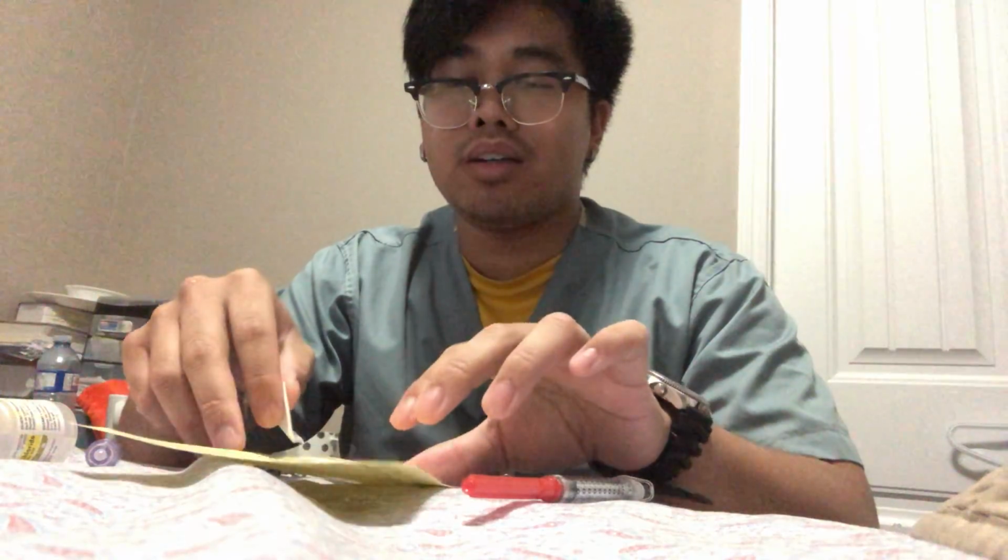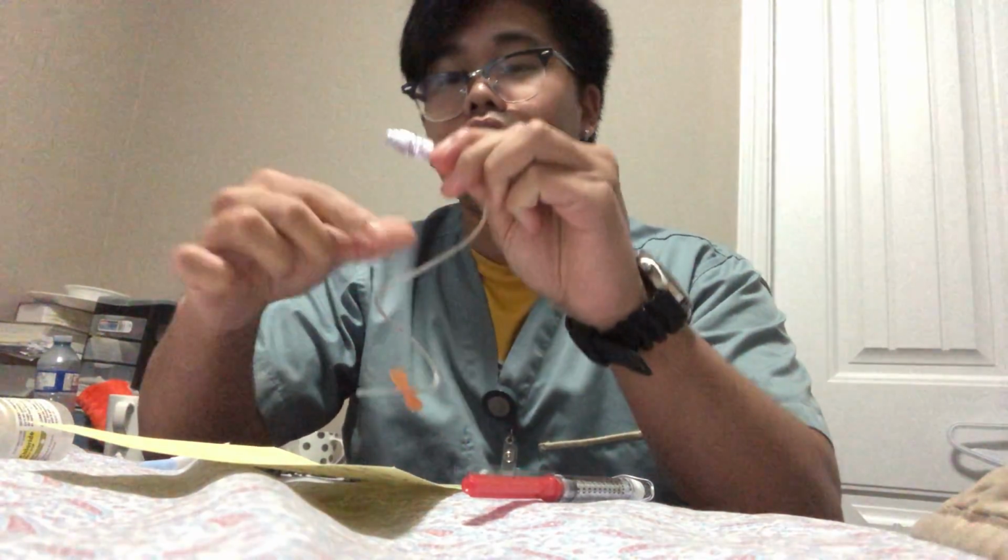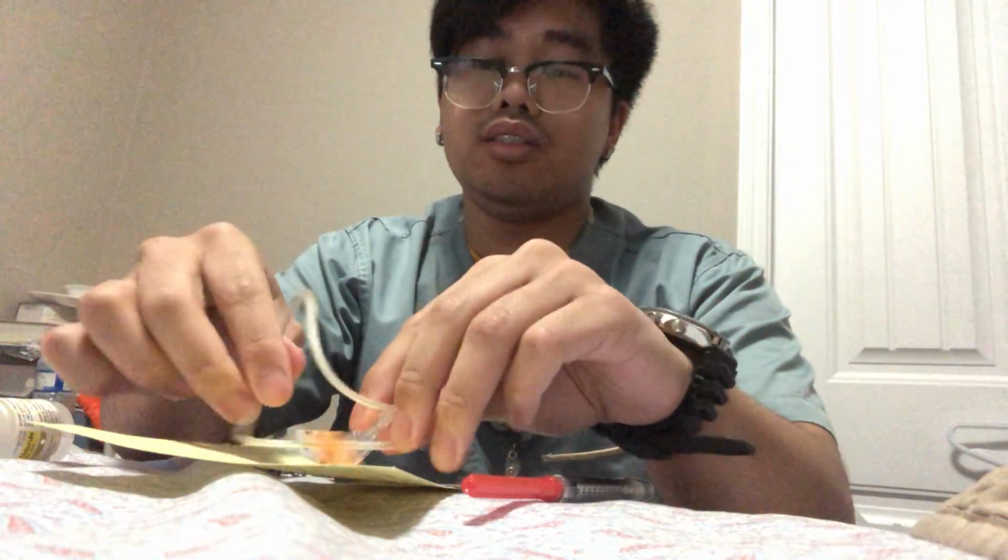And then I put my butterfly needle on my package, not on the table, and I'd get my neutral connector. So I'm gonna take this one off, and then I'm gonna clean the end. And as I clean the end, I'm gonna connect both of these two and then put them in the package, not on the table. Okay.